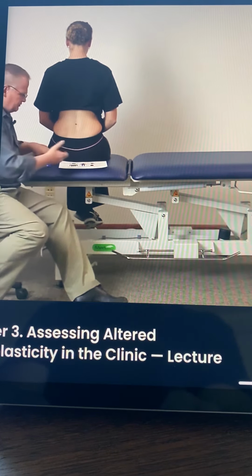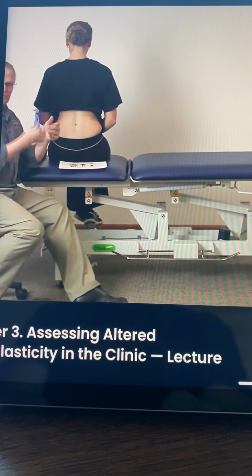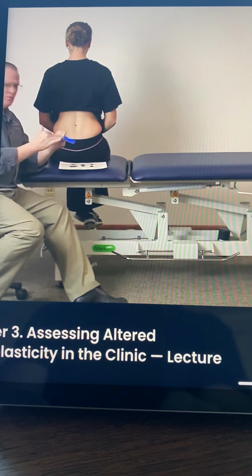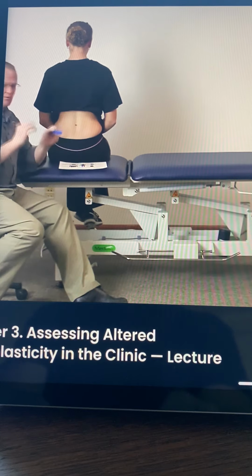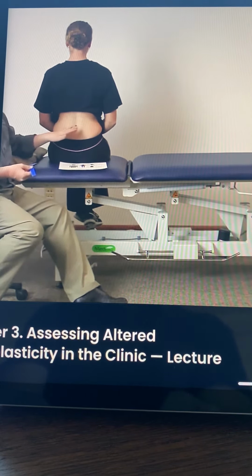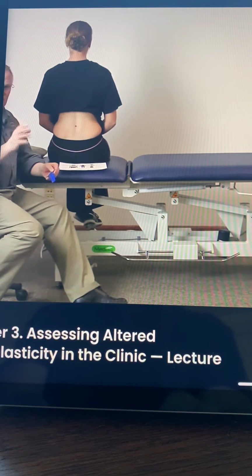If you look at the normative data, there are numbers, and again, there's a standard deviation. We use these simple little calipers. They're not that expensive. We strongly recommend they have sharper points and that they are plastic. The metal ones seem to also interfere a little bit with the normal sensation. If you look at the normative values for people with low back pain, the normative value is around 5.5 centimeters.